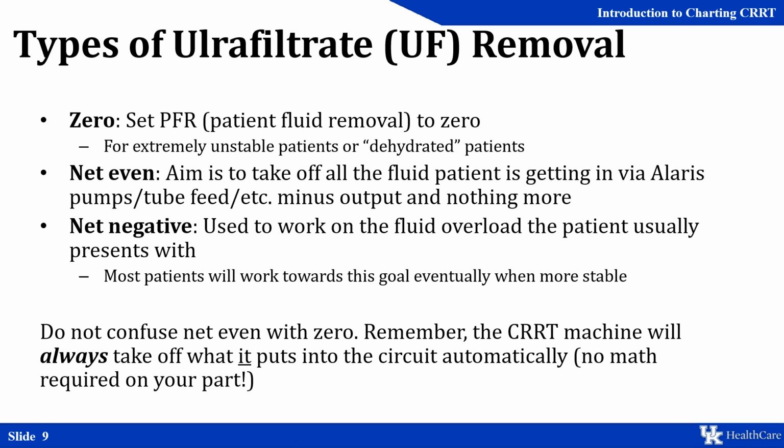Now, one thing that confuses people is confusing a PFR of 0 with net even. You can think of net even as net 0, but we don't call it that because it's confusing. Remember, the CRRT machine will always take off what it puts in and what it knows it's putting in, but it won't know what's going in through the Alaris pumps and what we give them.